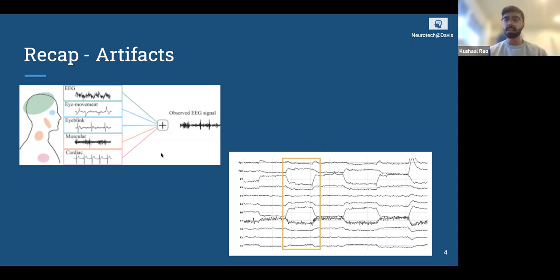And so that's why when you're collecting EEG data, it's important to not engage in any extraneous movements that can give off any noise or any electrical signals that you don't want. Usually when you have someone sitting with an EEG cap on their head, you instruct them to not move their body around too much or get up, because those electrical activities will impact the electrical activity we can get from the brain. And because we're already recording in microvolts, they're very sensitive, they're very small, and so we want to minimize that as much as possible.